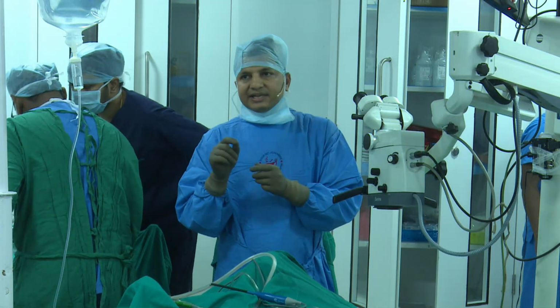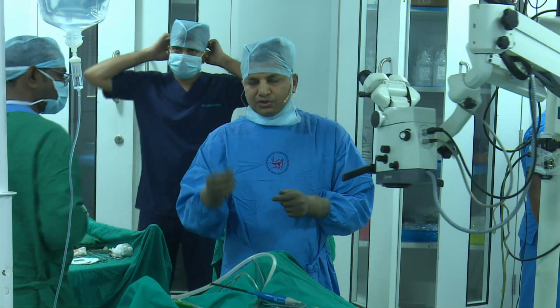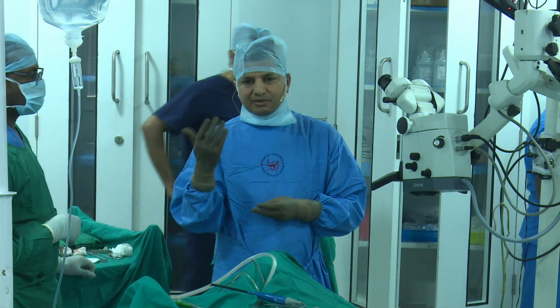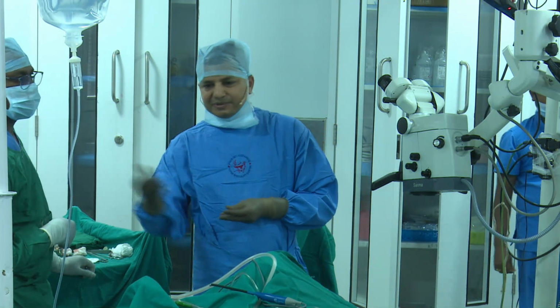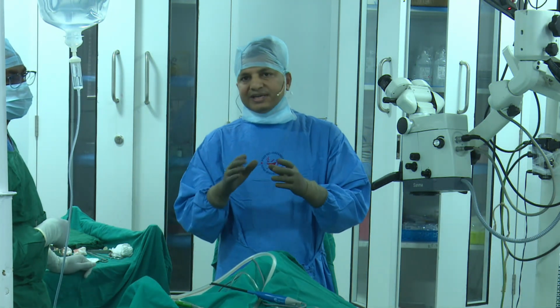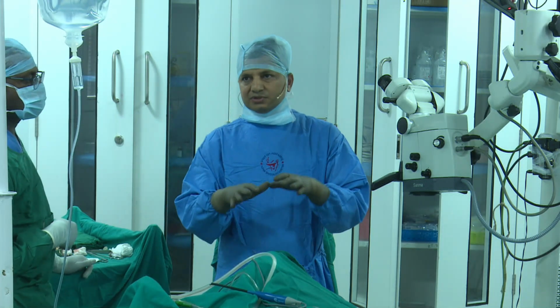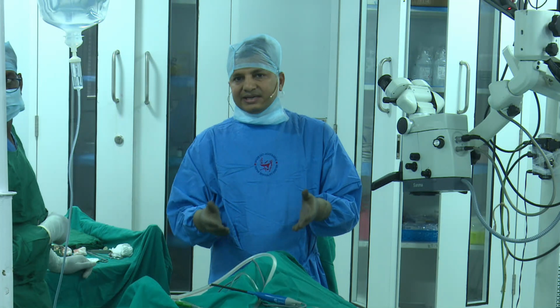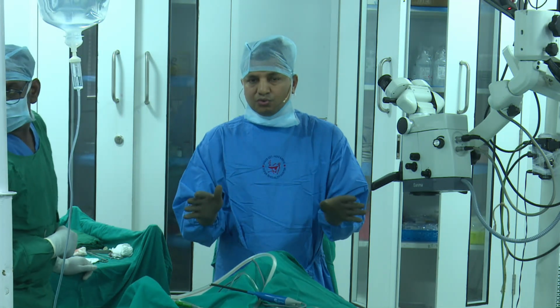DISE has definitely let us know what is happening today and what will happen later. So interventional DISE was again started by us around 10-12 years back. The word interventional DISE was not used by us, it is being used by some papers now. So DISE will tell you what is happening today and what can happen later. Now in this case, the tongue base was not a problem. It's very unlikely that tongue base will start collapsing later, but it's still a possibility. You cannot rule it out.